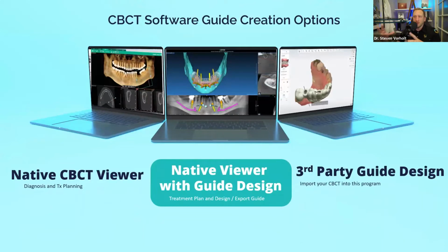There's another in the middle here that's a native viewer. So it comes with your CTs, its own viewing software, but it also has internal guide design. So you can treatment plan and design guides, export things. Then there's a third party guide design, which is going to allow you to bring in CTs from other machines and manipulate them in there and so on.